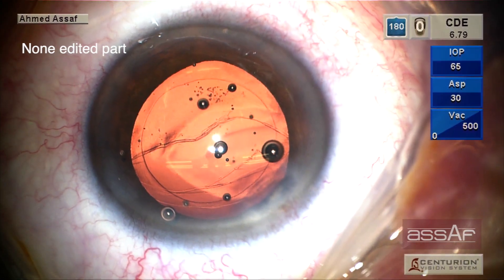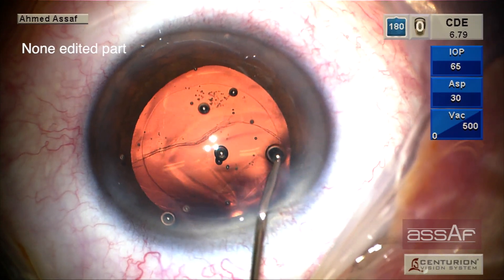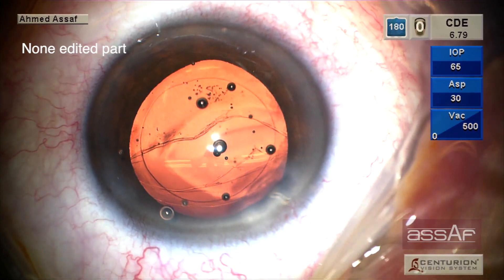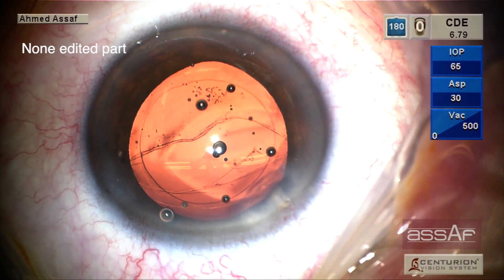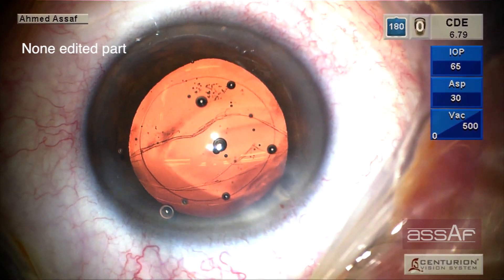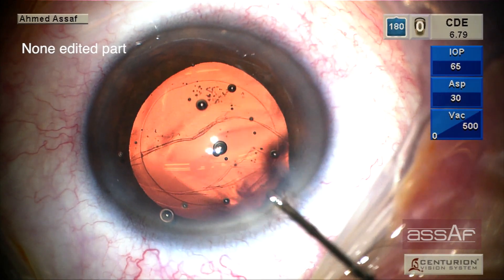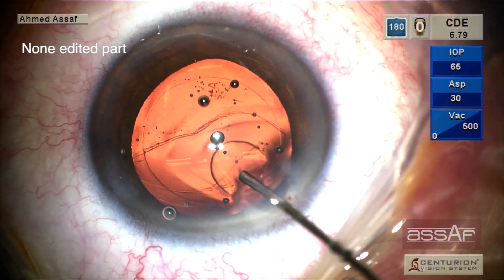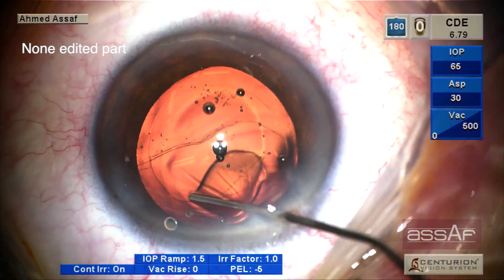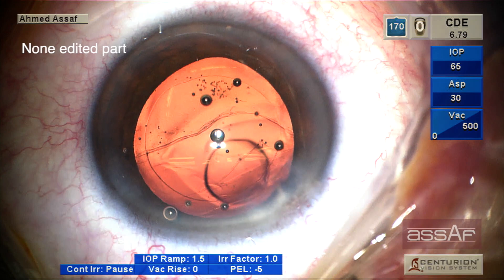So the first reaction was injection of OVD. It's preferable, of course, to start with dispersive OVD, but if dispersive OVD is not available, we can inject cohesive OVD.